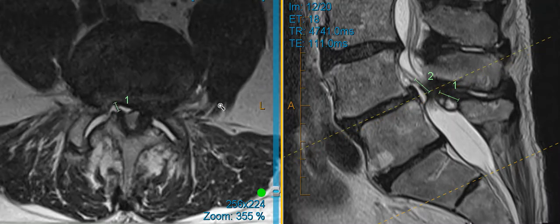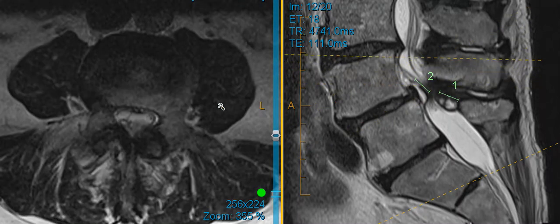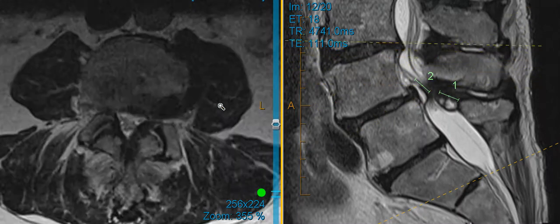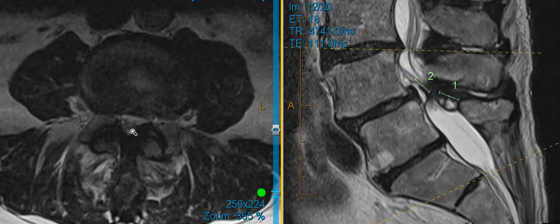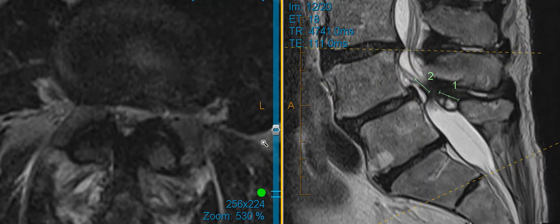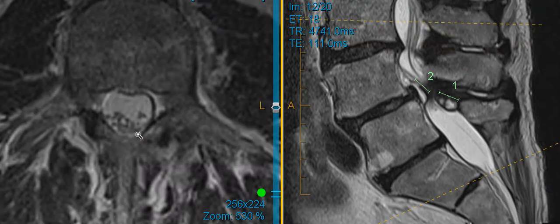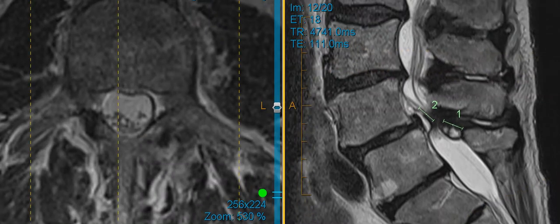Interestingly, this patient has some stenosis at the level above. So here's the L3-4 segment and you can see that the nerves are quite narrowed there as well. The joints aren't nearly as bad as they are at the L4-5 level and there's no cysts here, but he's got stenosis there as well, which I would definitely recommend addressing at the time of surgery.